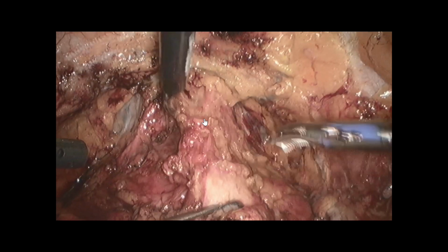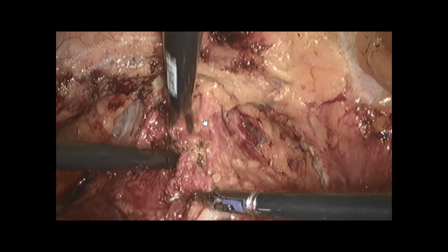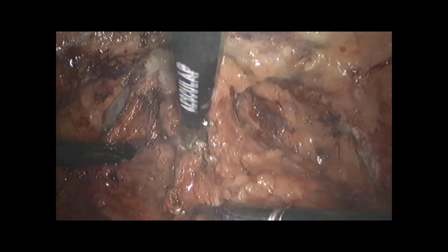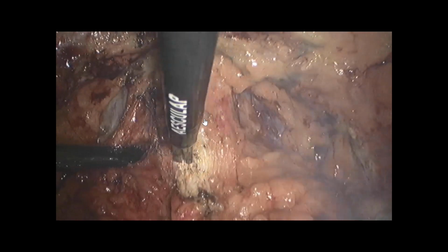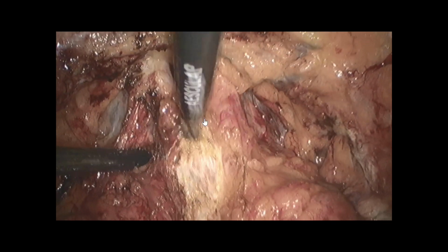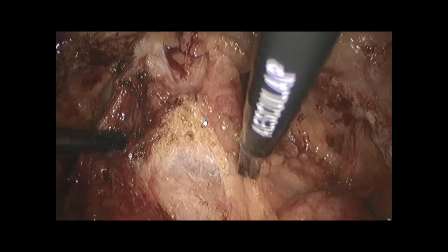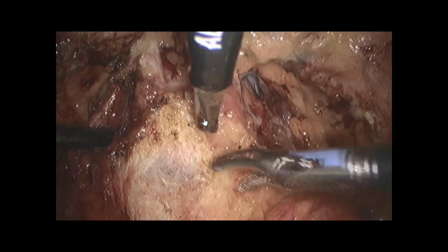So first, the bladder neck. We have just created the space, we have just placed the ports, and we start at the level of the bladder neck. You will see here in this patient, on the left side, no positive biopsy. So I didn't open the endopelvic fascia on this side, and on the right side, the tumor was a little bit bigger, so I have already done the opening of the endopelvic fascia. So I always start medially, and what I'm looking for is to try to see the urethra immediately. And you see that the pedicles, this is not the neurovascular bundle, the vesicoprostatic pedicles are just on both sides.